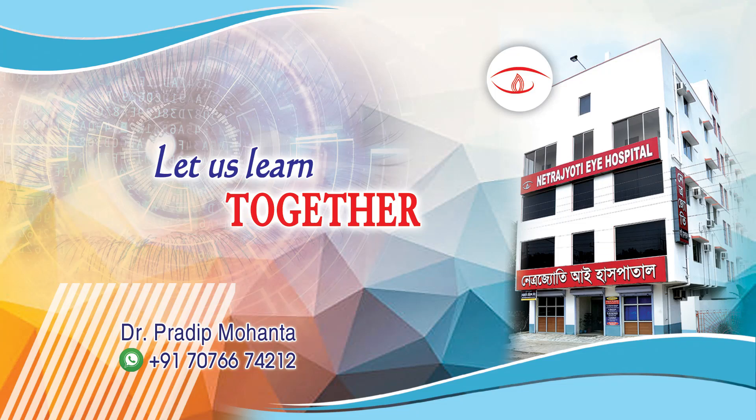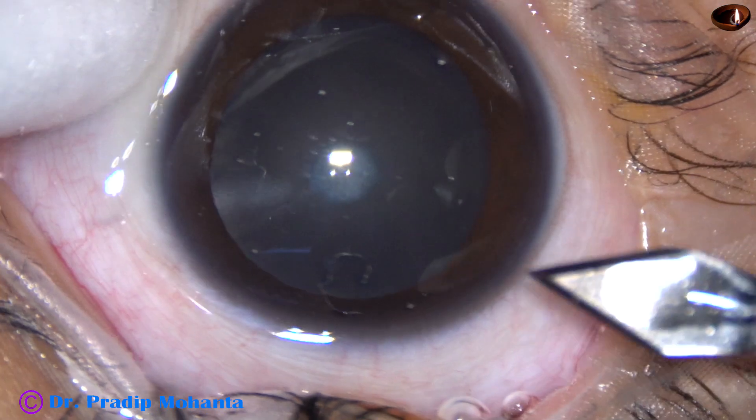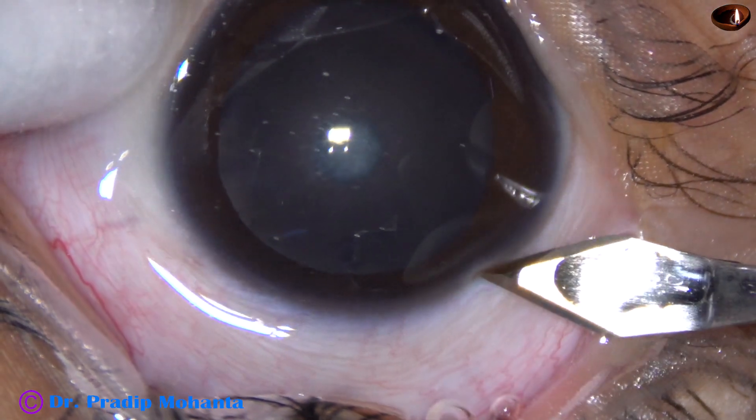Friends, welcome to my workplace at Ranaghat, West Bengal, India. This is a congenital cataract. The child is four years old. Let us observe this surgery.